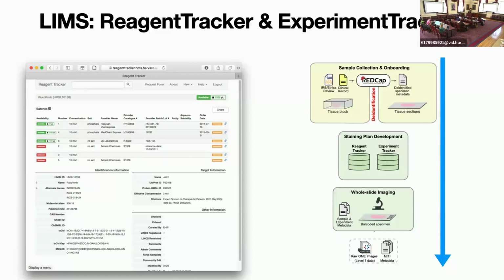So we've got a series of data curators and managers who enter information on these antibodies as soon as they come in. Things like the species and the target and the fluorophore and the vendor and the lot number and other quality control information that we've collected.